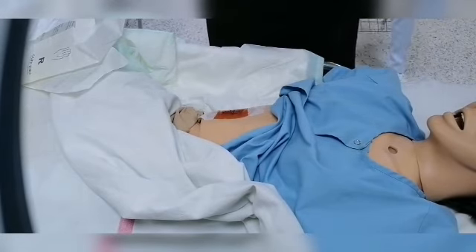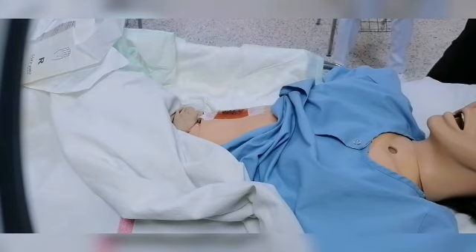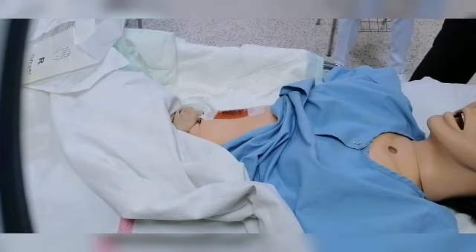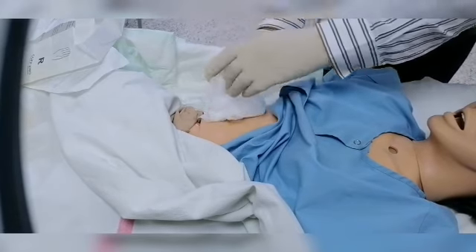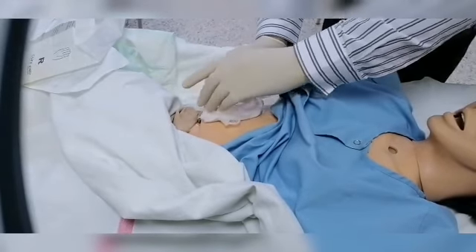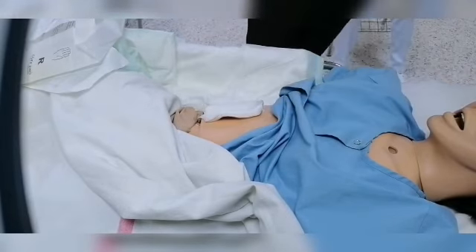After drying, I have to use pieces of gauze to cover the wound properly. I will choose the size according to the size of the wound.